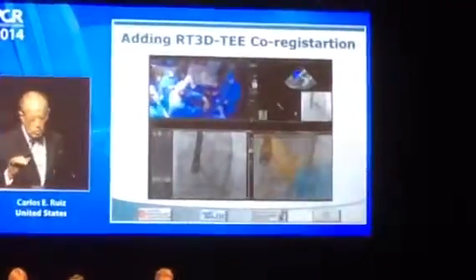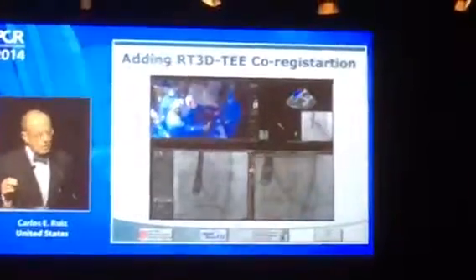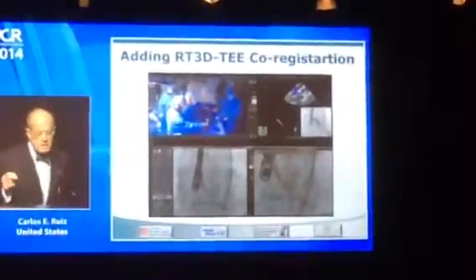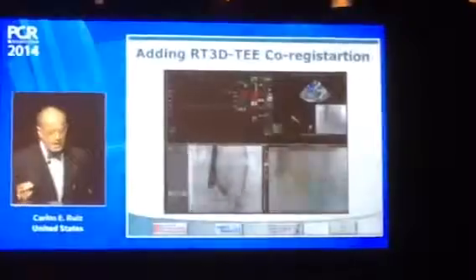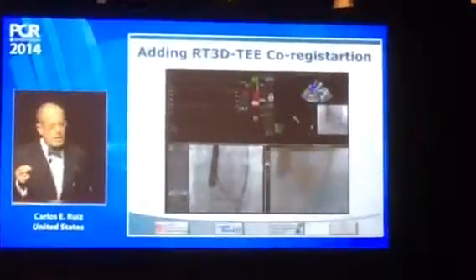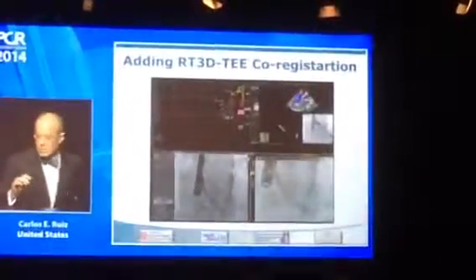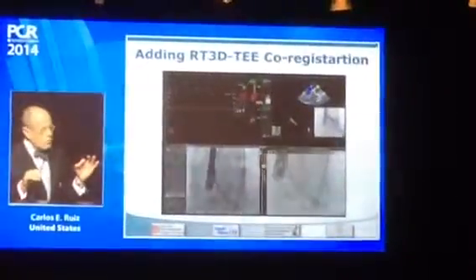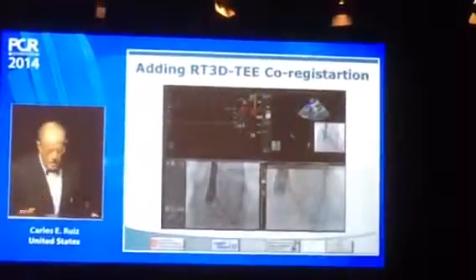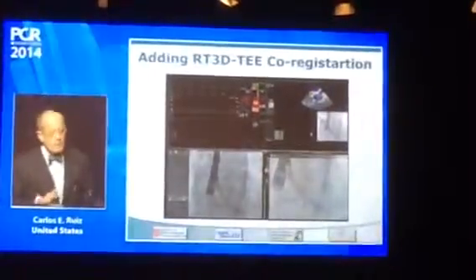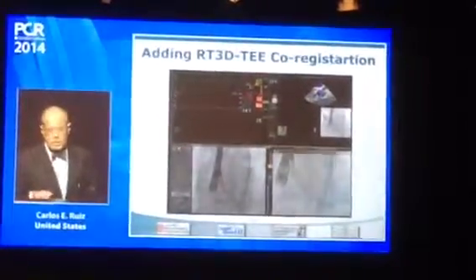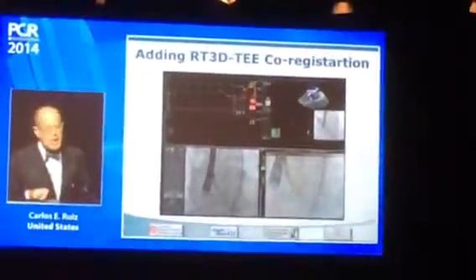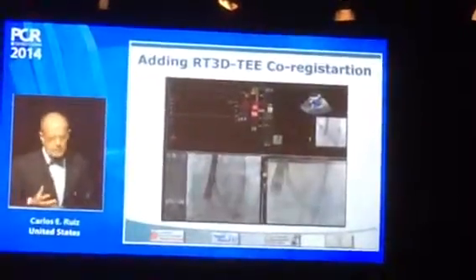As we saw from Dr. Zamorano, we can also use echo fusion. This is real-time — that is the big difference. This is not a pre-acquired image; what you see is what's happening at that moment. I can fuse the 3D echo — TEE as they call it here — with the fluoroscopy in real-time. This also allows me to overlay physiologic information, so I can see color flow Doppler superimposed onto the fluoroscopy and know whether I have a leak and in what part of the valve the leak is located.